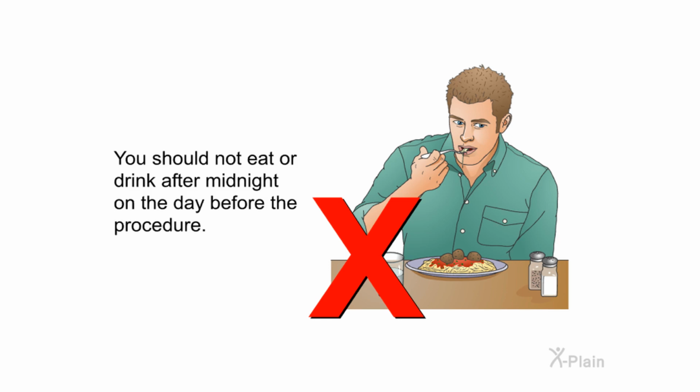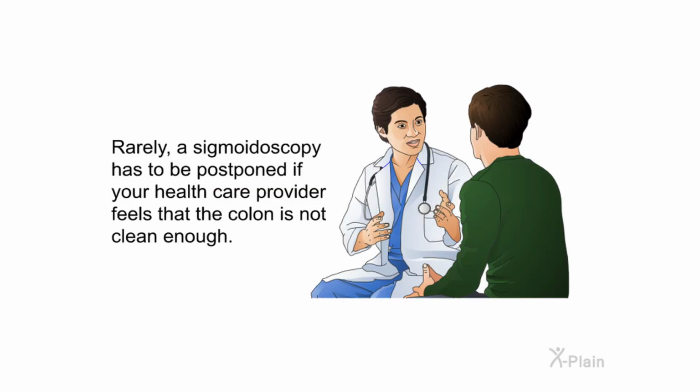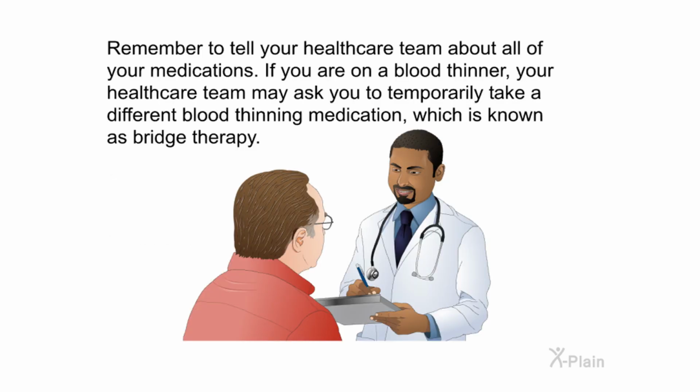You should not eat or drink after midnight on the day before the procedure. It is important to follow the instructions of your healthcare provider in order to have a clean colon. The cleaner the colon, the more likely it is that a sigmoidoscopy will find any potential problems. Rarely, a sigmoidoscopy has to be postponed if your healthcare provider feels that the colon is not clean enough. Remember to tell your healthcare team about all of your medications. If you are on a blood thinner, your healthcare team may ask you to temporarily take a different blood thinning medication, which is known as bridge therapy.